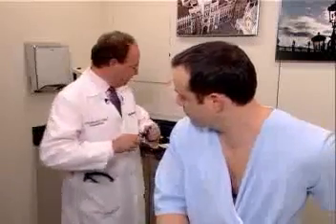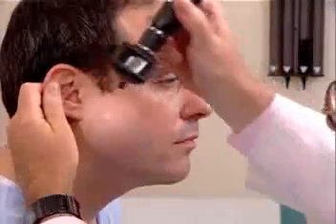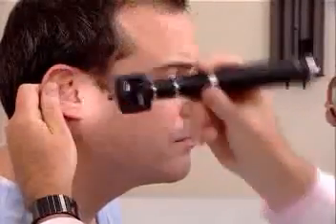I'm now going to demonstrate the otoscopic examination. The otoscopic head is put onto the handle, and the speculum — the largest diameter speculum — is used. In order to visualize the patient's tympanic membrane and external auditory canal in the right ear, the examiner places his left hand on the mastoid process and pulls up, out, and back, thereby straightening the external canal. The instrument may either be held this way to enter the canal or this way — either way is acceptable.